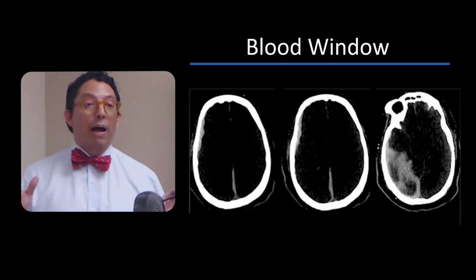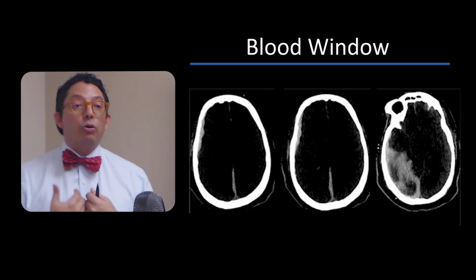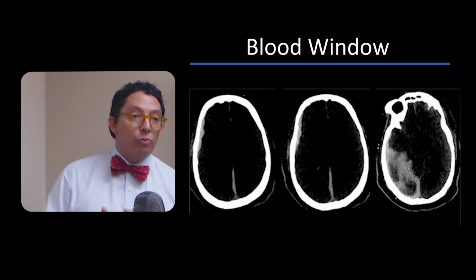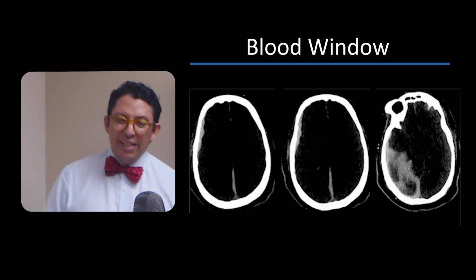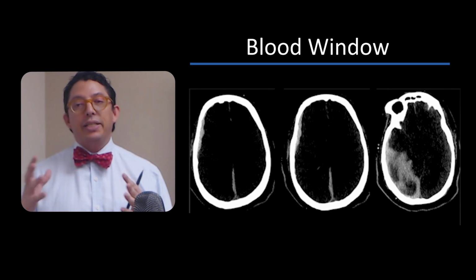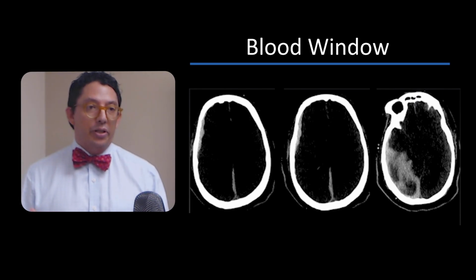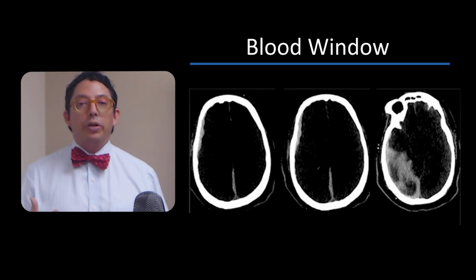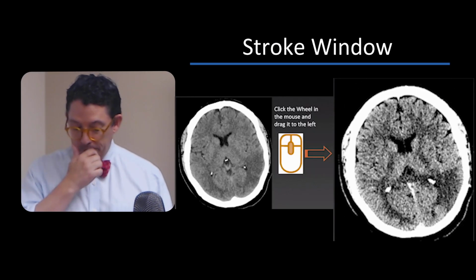Amazing. It's almost magical. So if you don't do this, you're going to be missing a lot of disease when you're interpreting these images. Typically, when you see a board case, they'll give it to you in the ideal window where you can see the disease. But for us in our daily routine, we have to do this to not miss lesions.